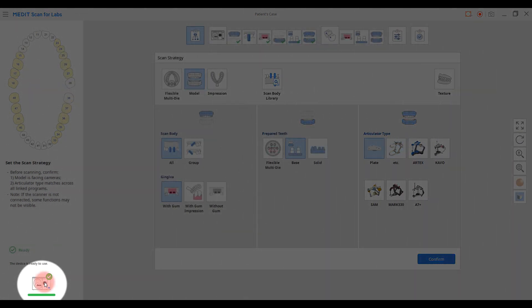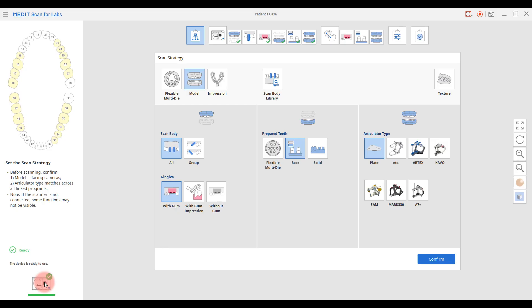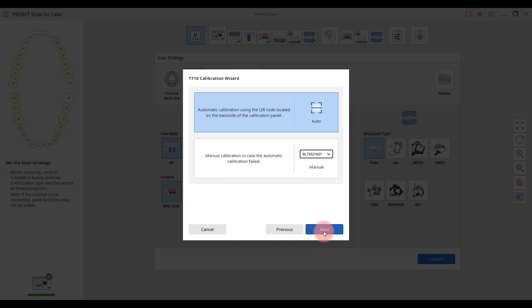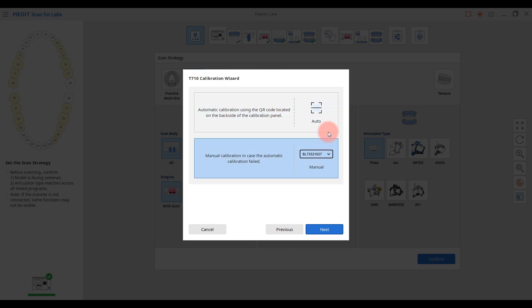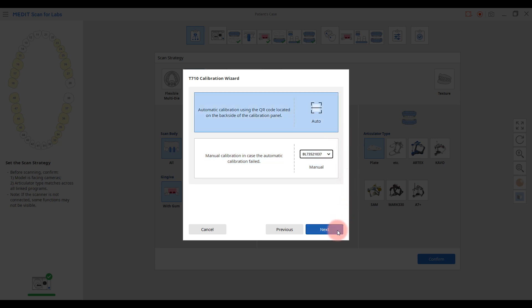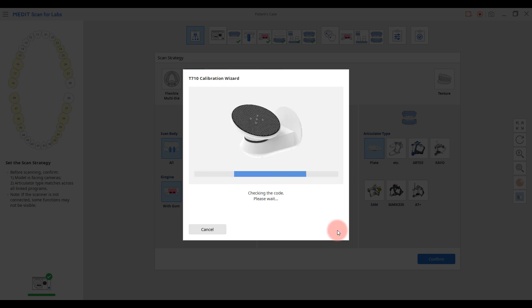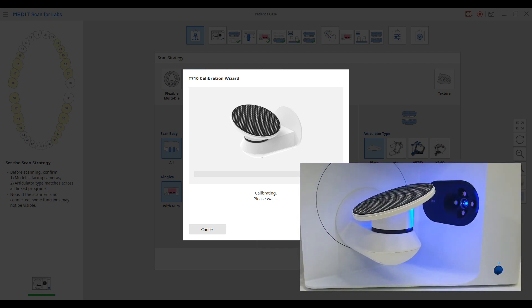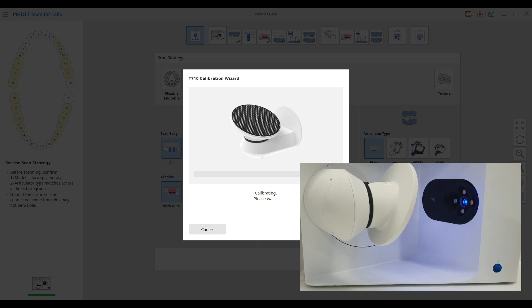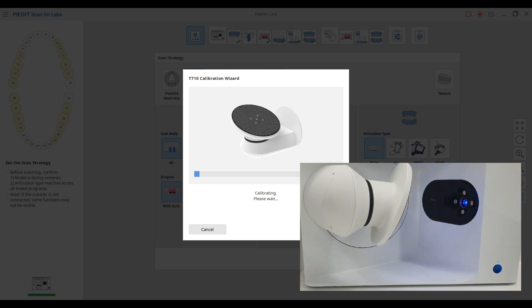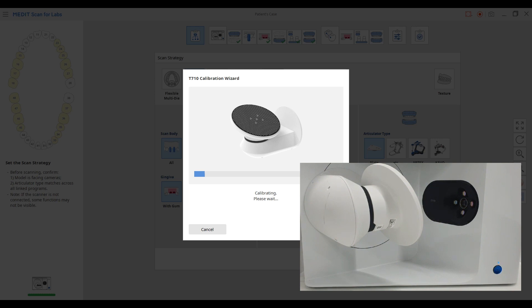Please calibrate the device in advance before scanning. You can start the calibration by clicking the icon on the bottom left. As you can see on the calibration wizard, the calibration will automatically be activated. If the automatic calibration doesn't work, please perform the manual calibration.